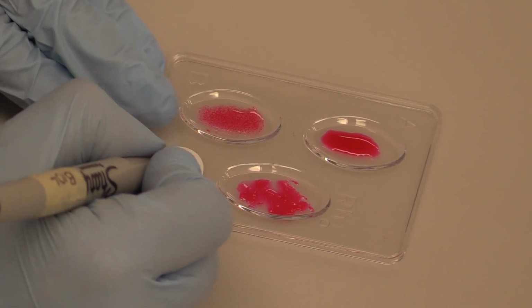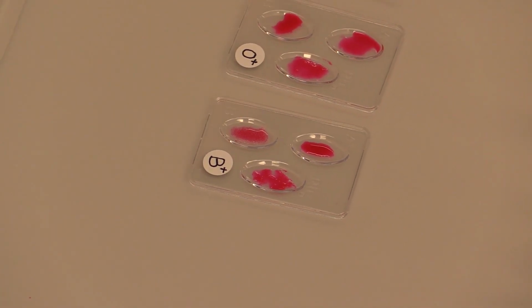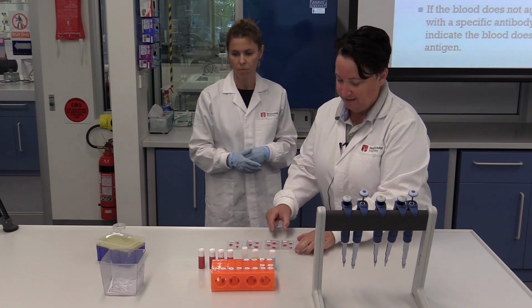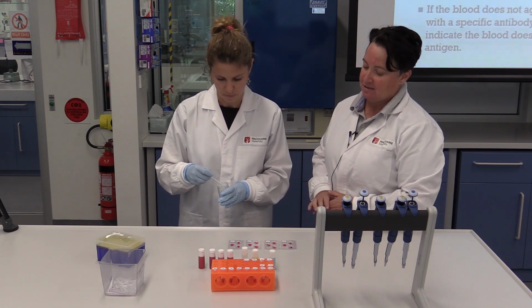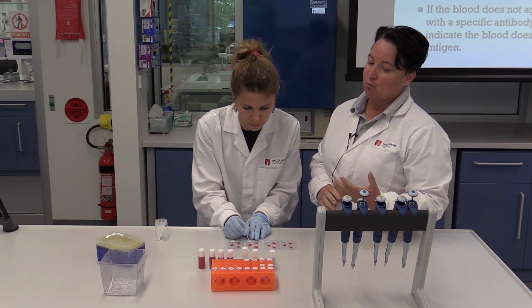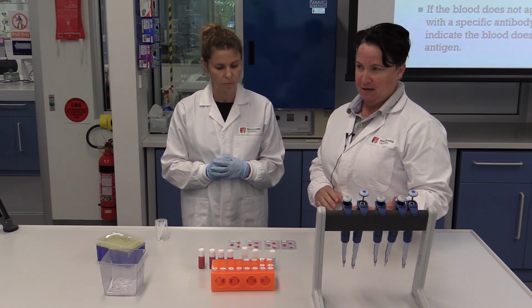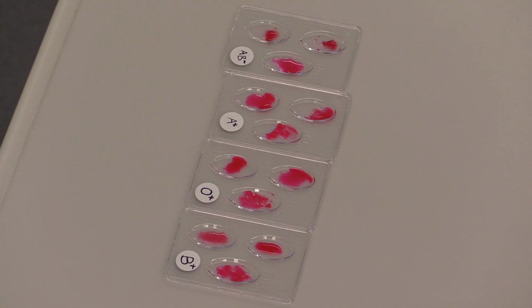Now we've actually set up controls for all our blood types, and they're not in any particular order at the moment, but you'll need to complete an exercise, and you'll use these positive controls, and then you'll use some still images that we give you to go through and work out the type for 8 patients, and we'll give you more information on how to submit that information in the prac notes.